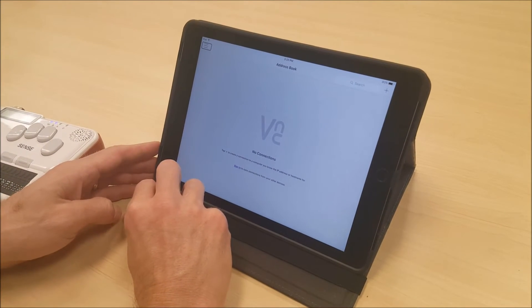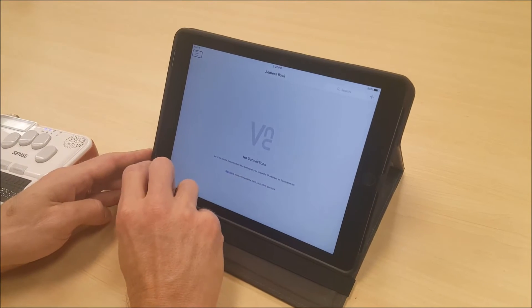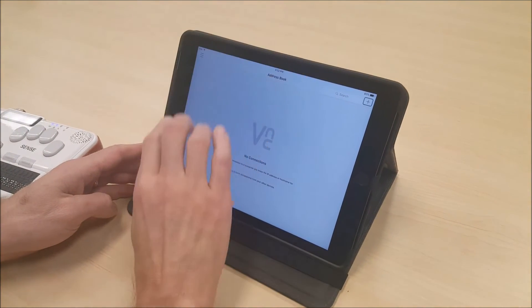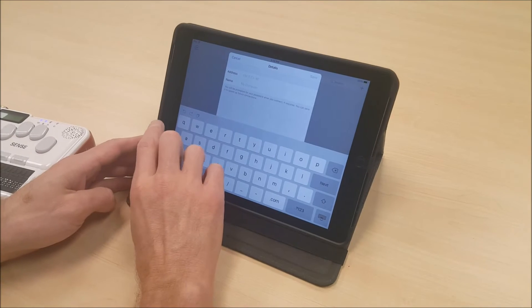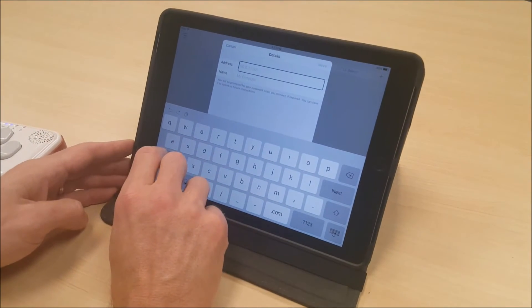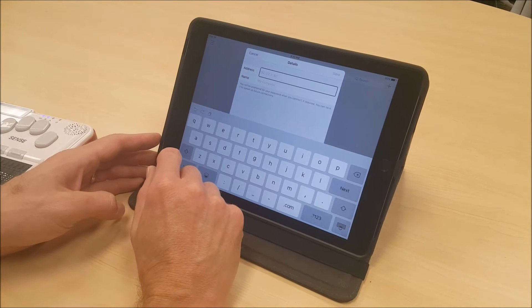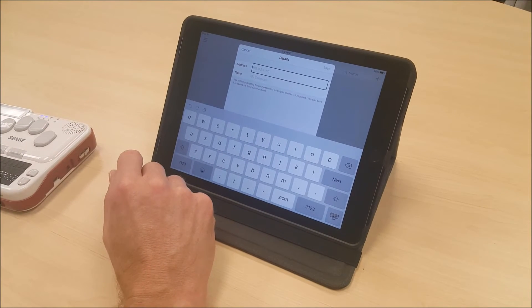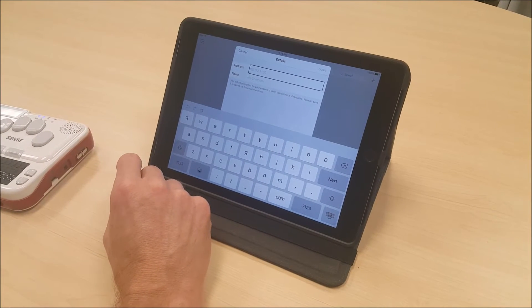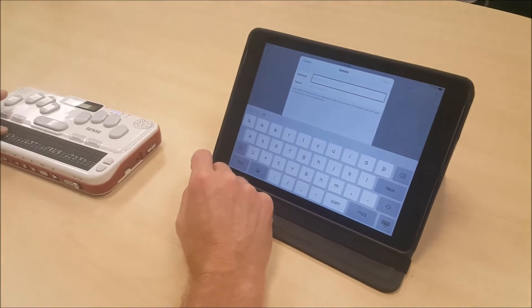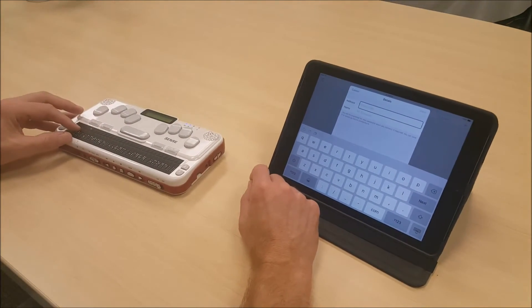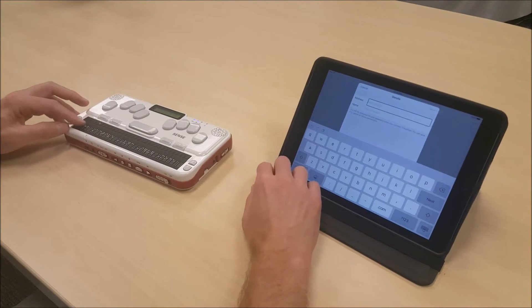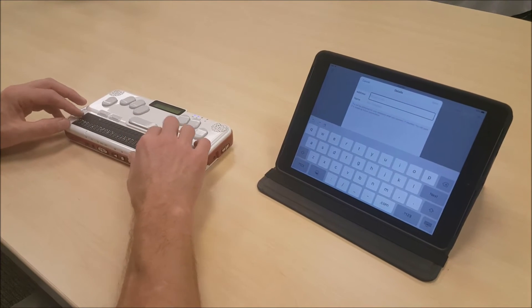Once I am in VNC Viewer, since I have not made a connection before, I am going to go to ADD CONNECTION. Now VNC Viewer needs some information from me — it needs to know the IP address that is on my BrailleSense. The IP address is Wi-Fi network specific, so if you use VNC mode with VNC Viewer on multiple Wi-Fi connections, you will need to set up multiple VNC Viewer connections on your iPad or other tablet.